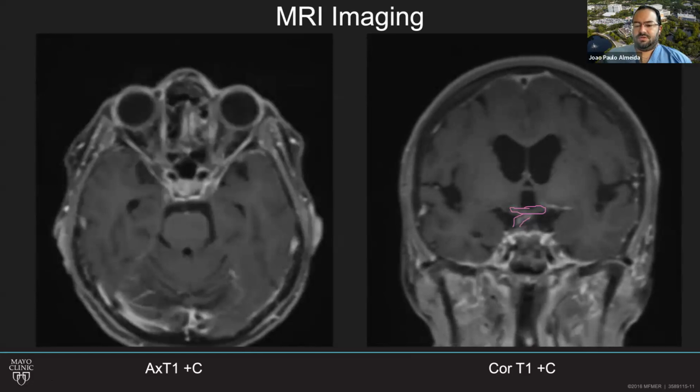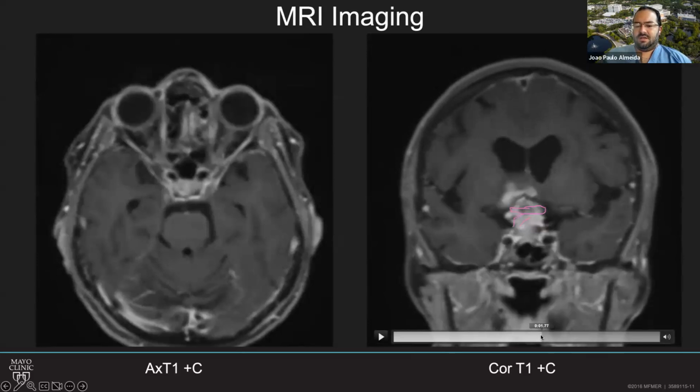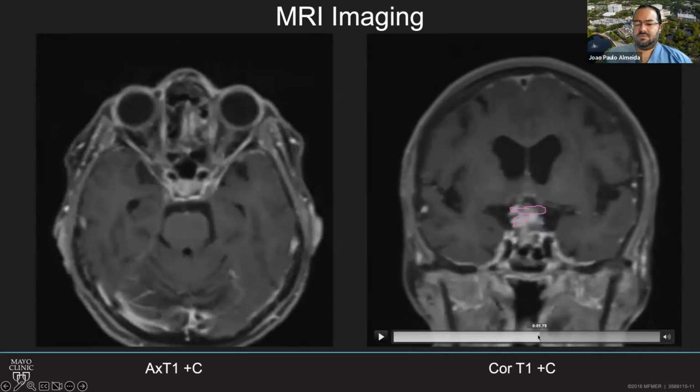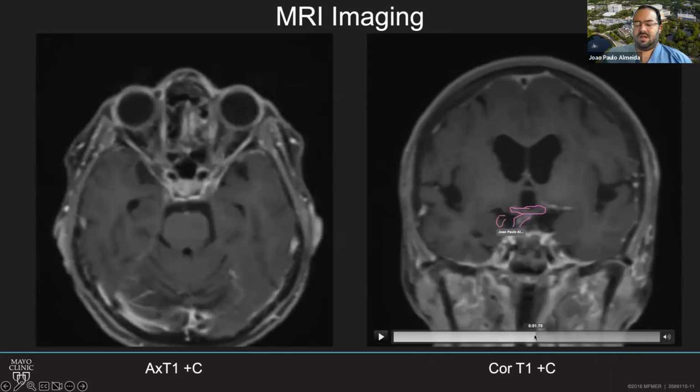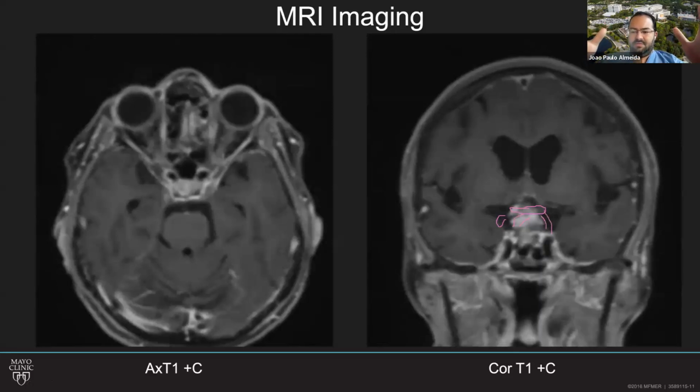If you scroll slowly, going towards the frontal sinus, yes. In this image, maybe it's not well representative, but the optic chiasm and the optic nerves were displaced inferiorly and laterally by the tumor mass, which represents as well the direction of growth of this tumor.